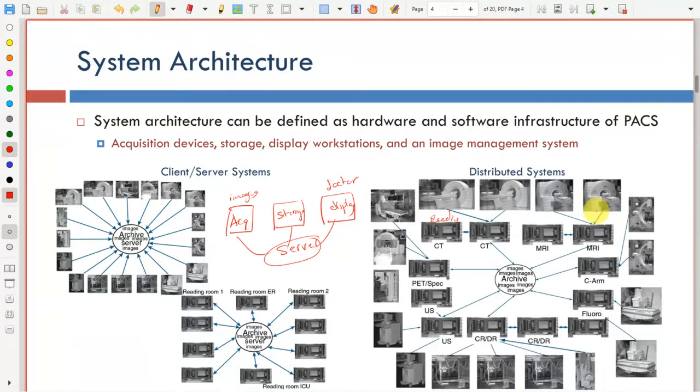So these are connected directly to the MRI systems. It's different when you have systems like this. Instead of going to the server to collect the data, they collect it directly from the imaging systems, and it's collected here. If this one here needs the same data, it communicates with this one to collect it. So the imaging systems are connected to dedicated workstations that work only for these particular modalities. And if you have another one, then this will communicate with the other ones working on the same modality. This goes on for each one of the different systems.